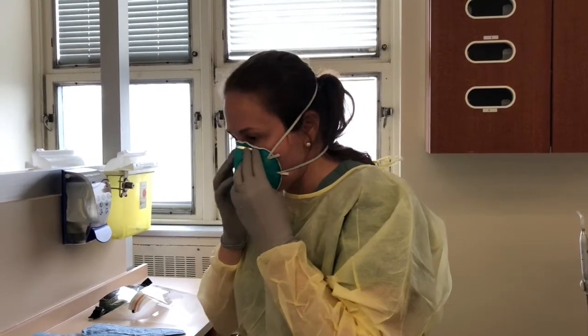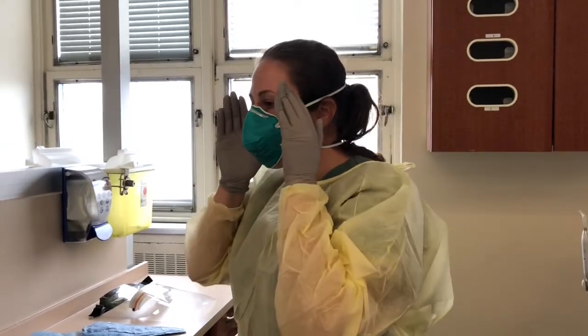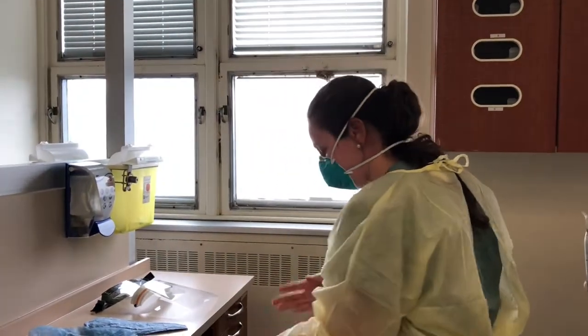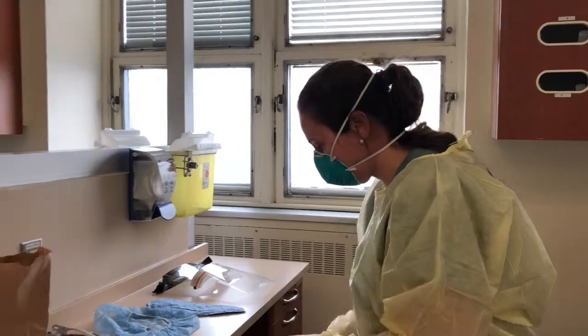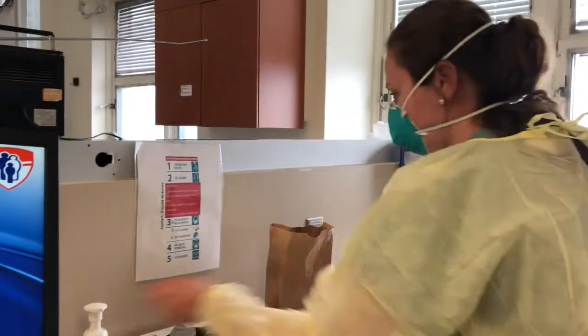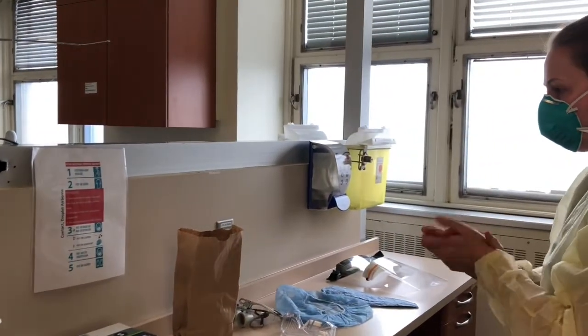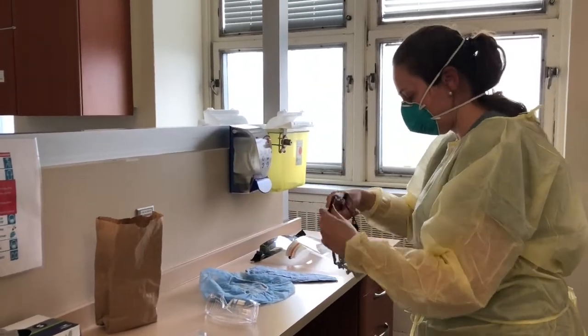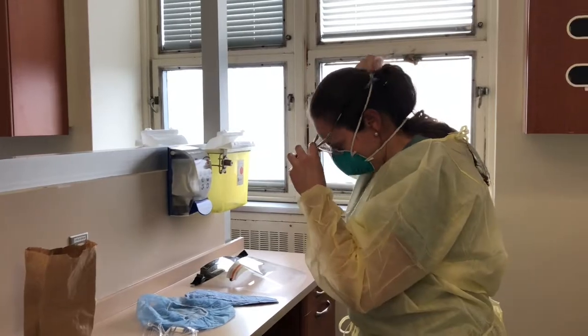Pinch the nose piece and perform a fit check by blowing with hands held above, to the sides, and below your mask. If air leakage is apparent, adjust the mask and repeat the fit check. Remove and discard your gloves and use hand sanitizer. Apply and adjust your loops.